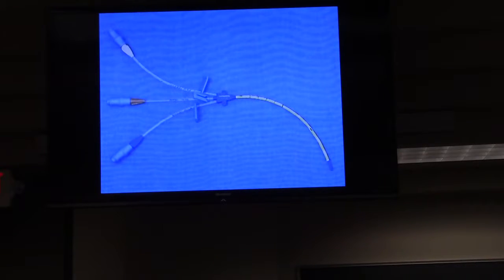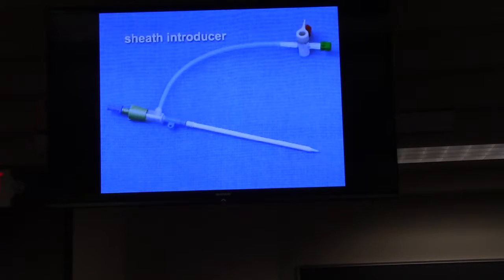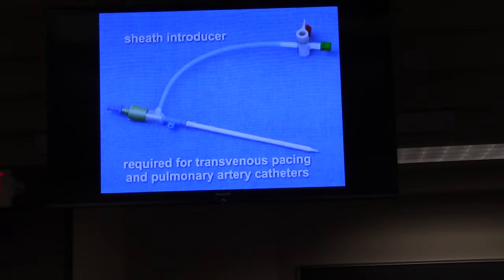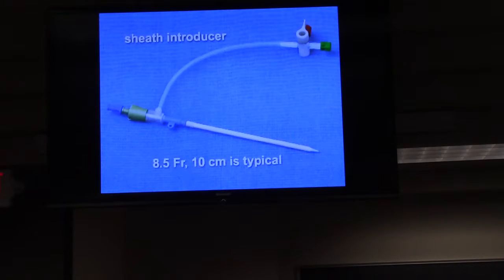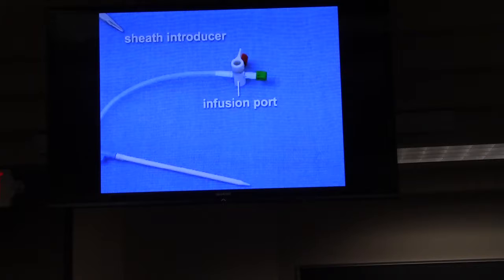A central venous catheter. Triple lumen catheters, as pictured here, are most frequently used. Size 7 French 16 centimeter catheters are typical, but other sizes are available. Triple lumen catheters offer 3 infusion channels that may be used to administer a variety of fluids or medications. Sheath introducers may be chosen instead of triple lumen catheters if a transvenous pacing or pulmonary artery catheter needs to be inserted. These devices are large. 8.5 French 10 centimeter is typical, and often include a sidearm infusion port in addition to the main lumen.